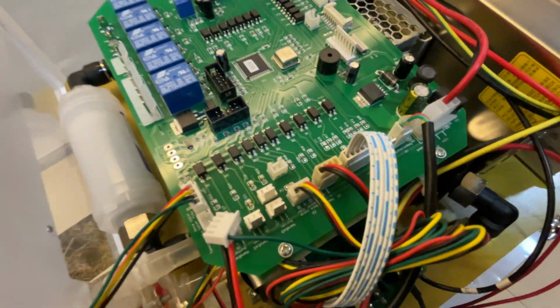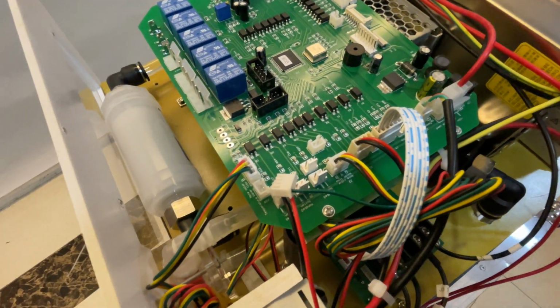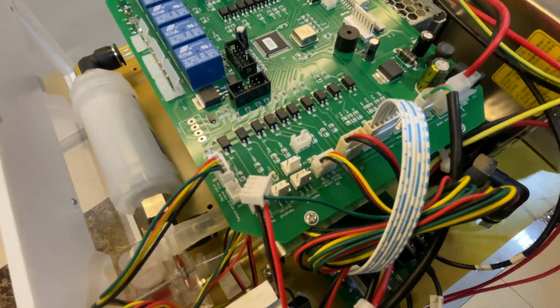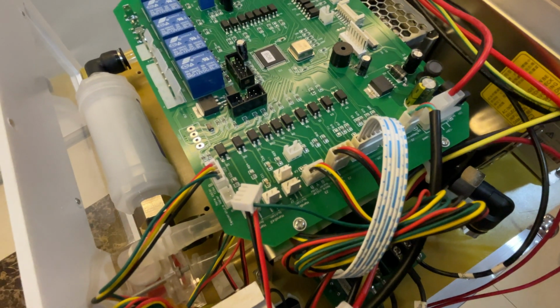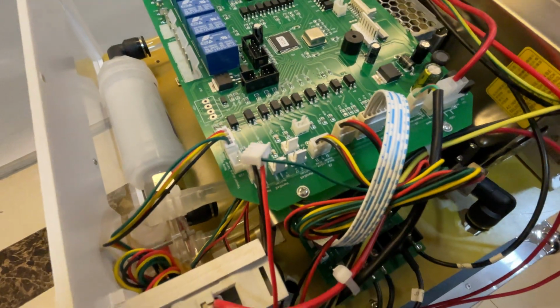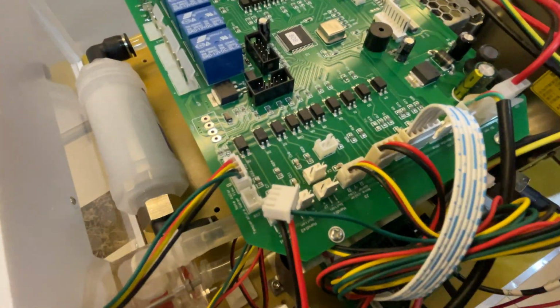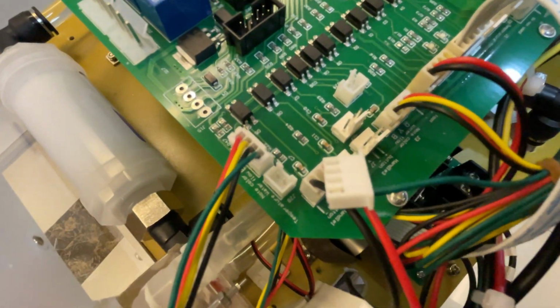Without filming videos, your thinking wouldn't be shown; it's not ordinary people's thinking, so we must film it, otherwise nobody knows what you have thought up. Esto es el pensamiento de nuestro ingeniero Mr. Yu. This is wonderful, very thankful work of our engineer. Great job. Two water flow sensors, like two engines of an airplane, and also consider the compatibility between the previous control boards and the actual control board, with two connectors.